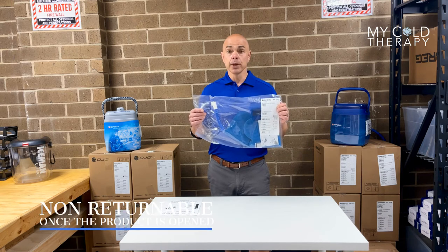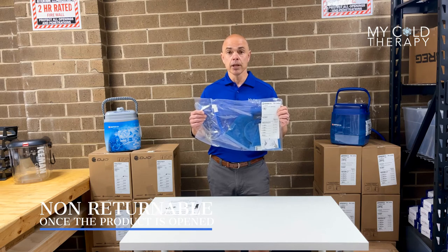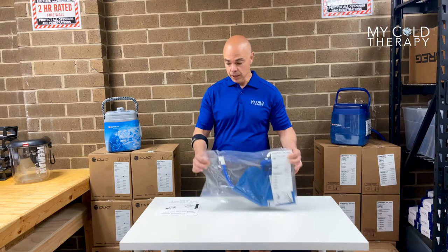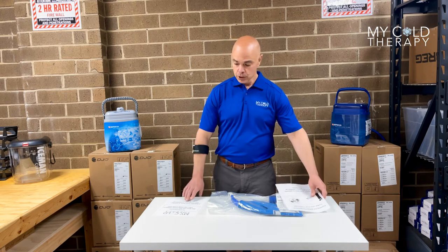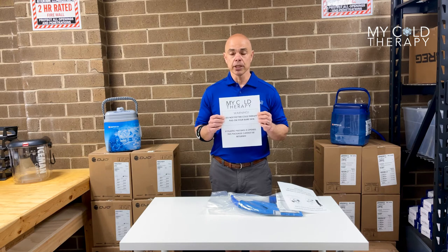Once this bag is opened it is non-returnable. Most of our pads go to surgery patients and because of the risk of infection we cannot send out anything unopened. You're going to get a warning letter with every single Bragg pad that shows the difference between a Kodiak and a cube. Please take note of your connections before you open the bag. You're also going to get the skin warning label which says please do not put this on your bare skin because you could risk harm.